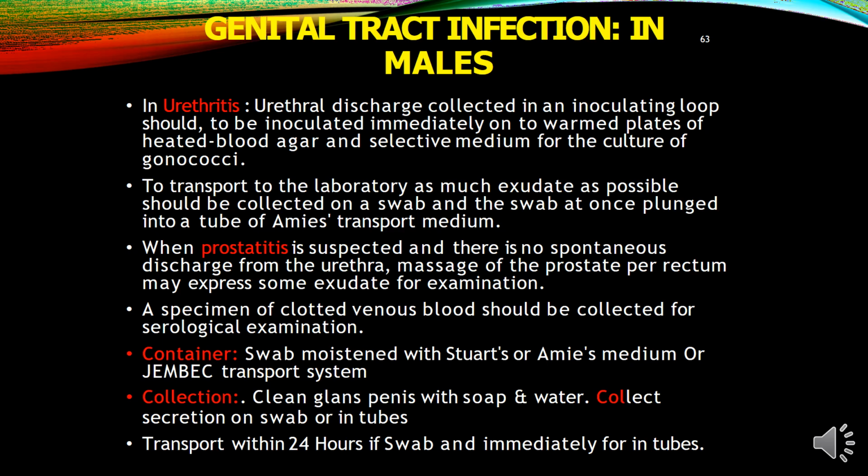When prostatitis is suspected, there is no spontaneous discharge from the urethra. Massage the prostate per rectum and it may express some exudate for examination. A specimen of clotted venous blood should be collected for serological examination. Containers used are swabs moistened with Stuart's, Amies media or Jembec medium.